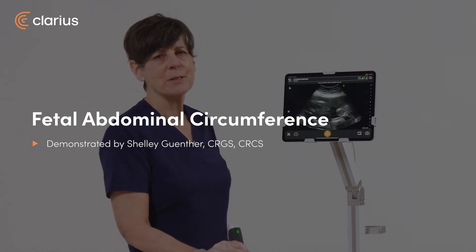Hello, my name is Shelley. Today I'm going to be showing you how to get a fetal abdominal circumference measurement with the Clarius C3 scanner.